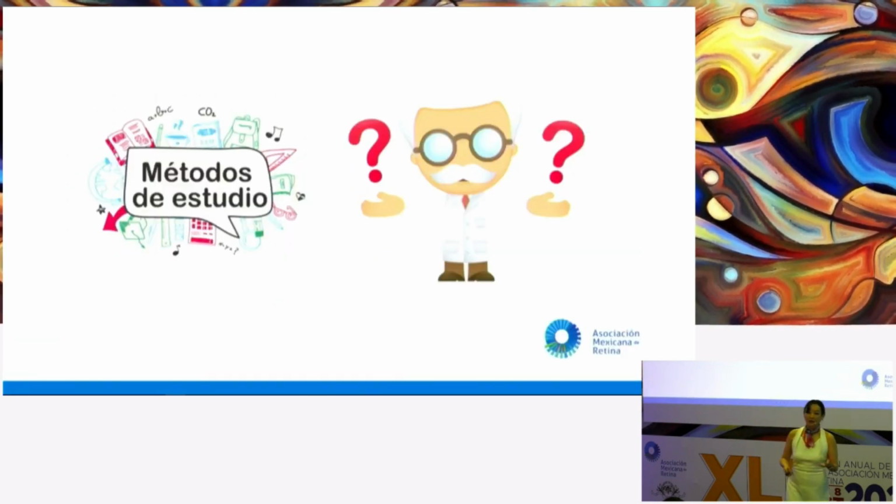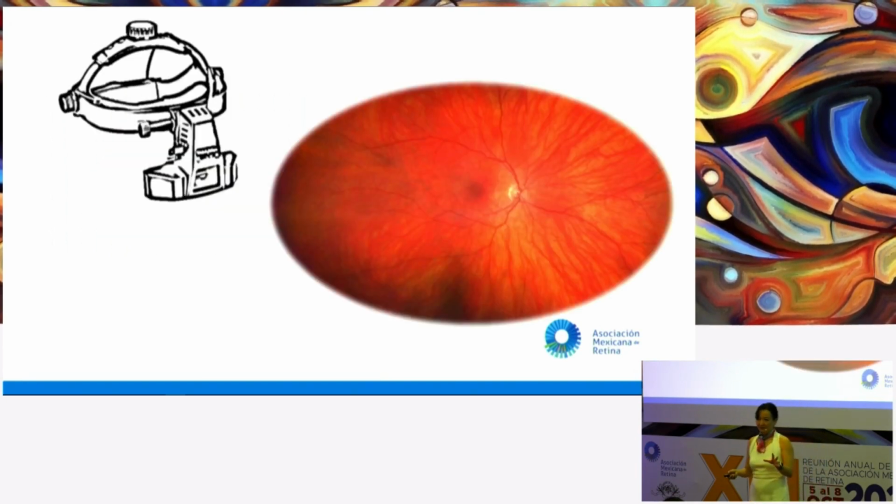So let's go back to the question: which are our study methods? Without any doubt, the queen is physical exploration, that is ophthalmological exploration. Thanks to this, we will come down to a diagnosis, a diagnostic suspicion, and we will decide whether we need to carry out a paraclinical study or not.